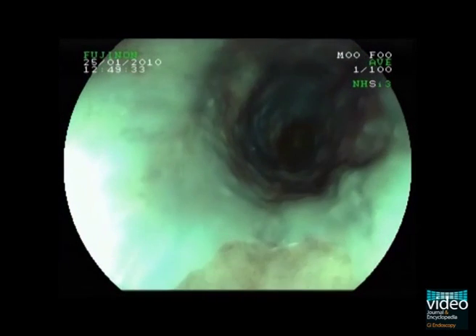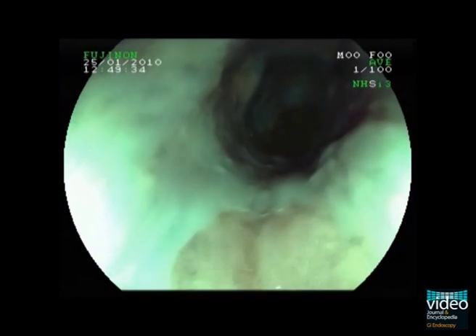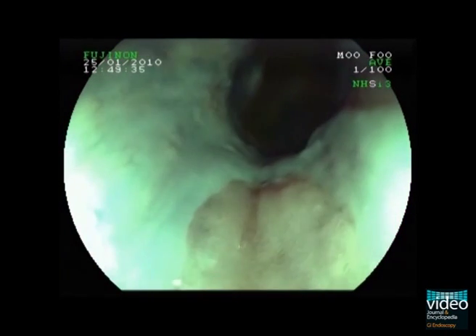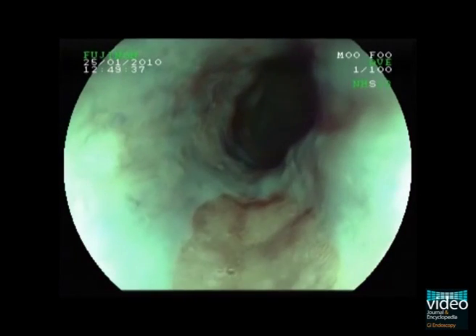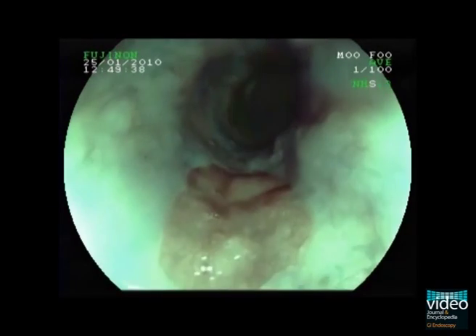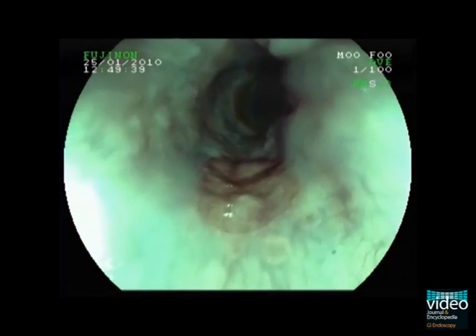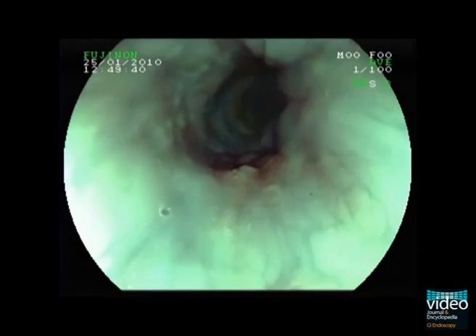Virtual chromoendoscopy using FICE enables an increased demarcation of the gastric inlet patch to the surrounding esophageal squamous epithelium.